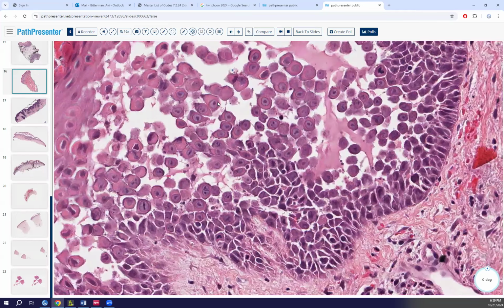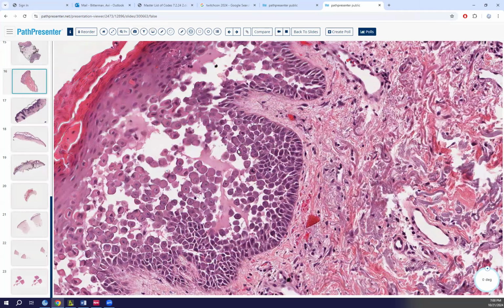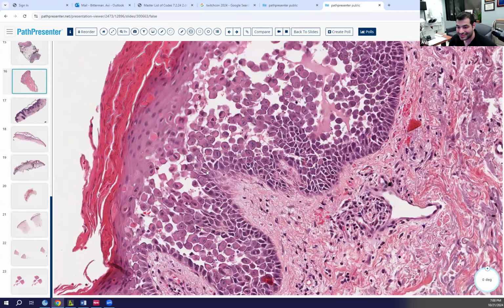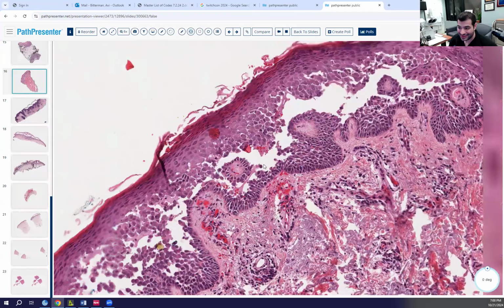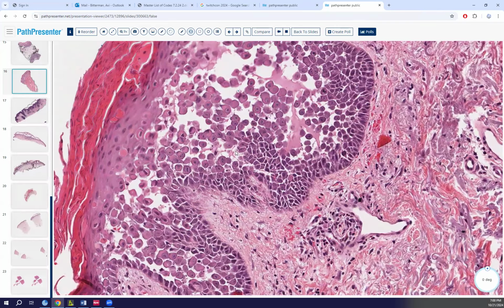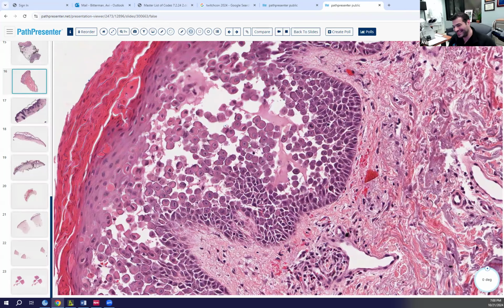No. What do we see? Acantholysis. Did we say that already? It looks more diffuse. Okay, and there's also some dyskeratosis, but not a lot. Corps ronds. Is this like more of a dilapidated wall? This is the dilapidated wall, but really what I want you to notice is not so much the dilapidated wall.